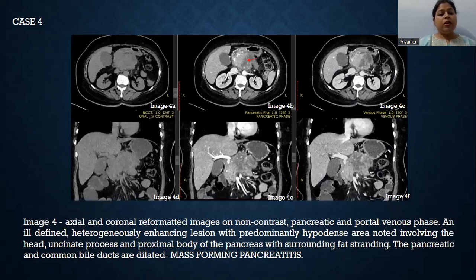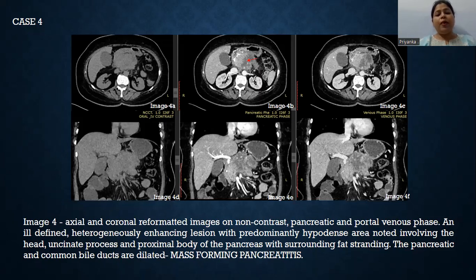This is an axial and coronal reformatted image on non-contrast, pancreatic, and portal venous phase. In this case, an ill-defined, heterogeneously enhancing lesion with a predominantly hypodense area is noted involving the head, uncinate process, and proximal body of the pancreas with surrounding fat stranding. The pancreatic duct and the common bile duct are dilated, suggestive of mass-forming pancreatitis.